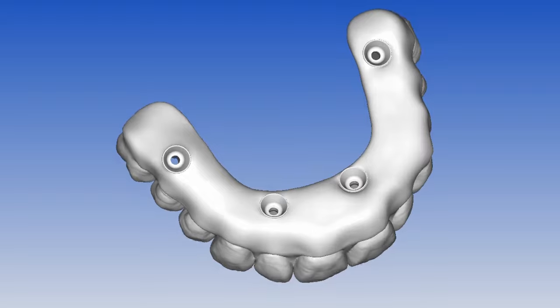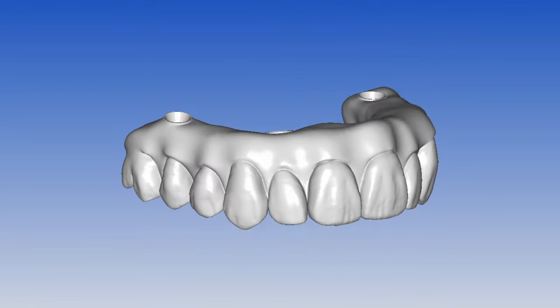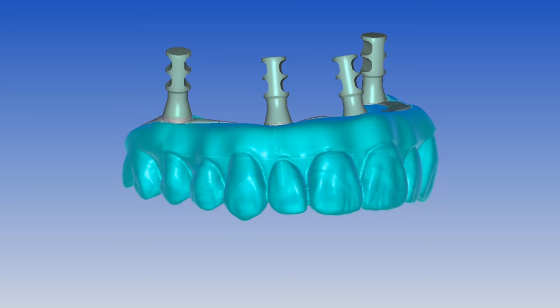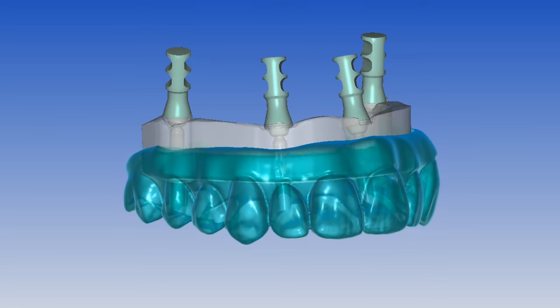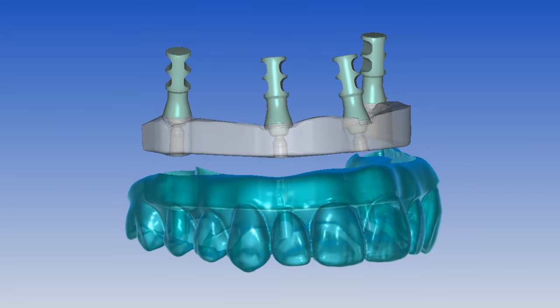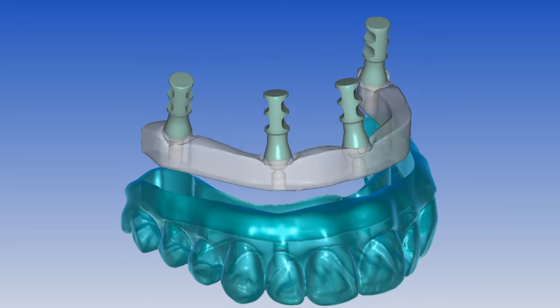What if you could take any STL of an all-on-4 case, direct to multi-unit or with ti-bases and had no scan flags, but could design a bar and split it from that STL to mill a zirconia hybrid or an overdenture with titanium bar.